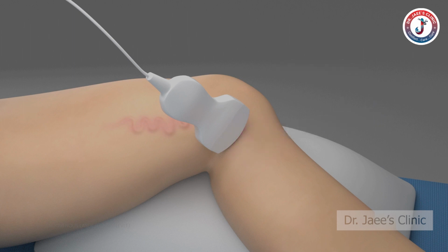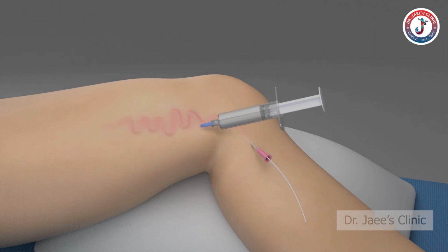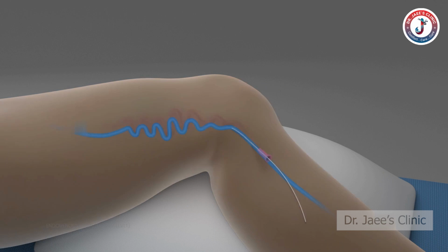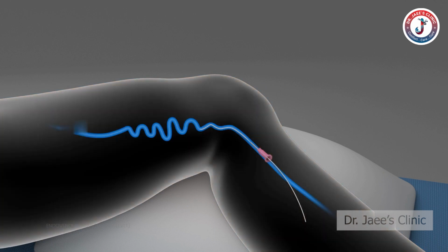Once the skin is numb, a needle is used to make a small puncture hole in the saphenous vein. A catheter, thin tube, providing the laser heat source, is placed into the affected vein. Additional numbing medication may be administered around the vein prior to ablating or destroying the varicose saphenous vein. Using imaging assistance, the catheter is guided to the treatment site, and the laser fiber at the end of the catheter is fired up to heat up the entire length of the vein and seal it closed.